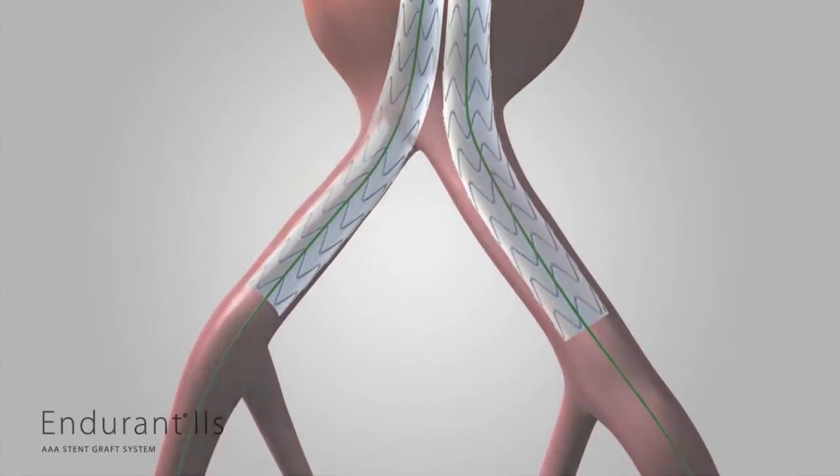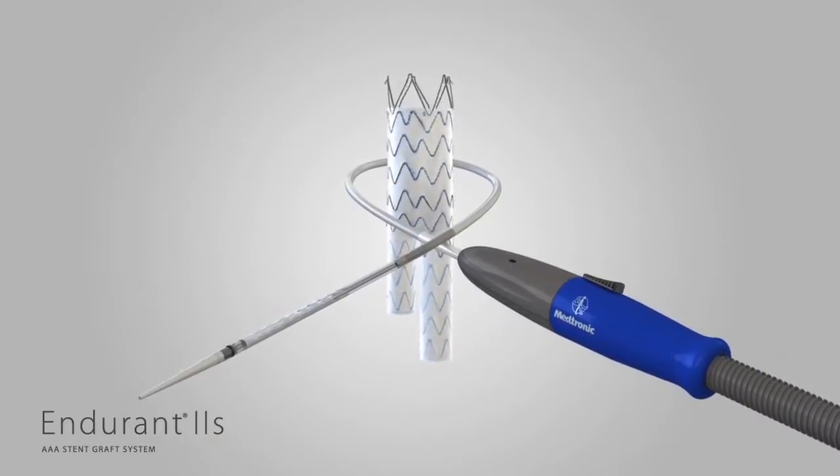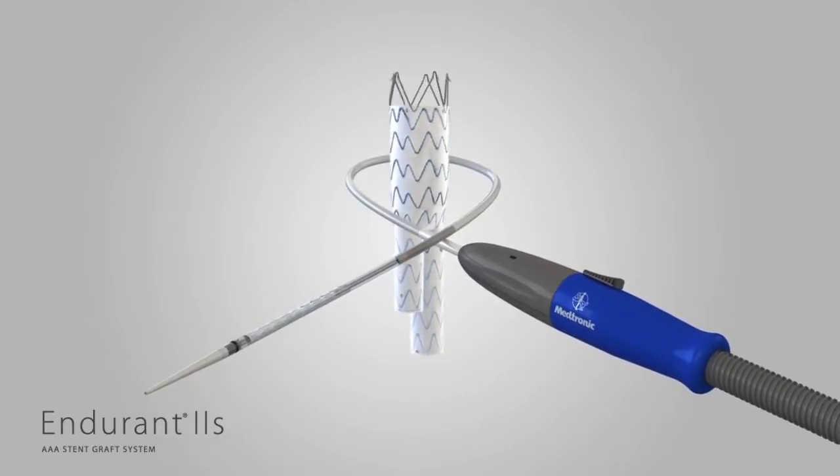If other stent graft components are needed to complete the procedure, please follow the deployment steps as used with Endurant 2 and outlined in the IFU.